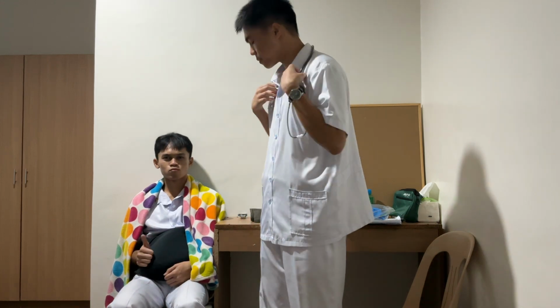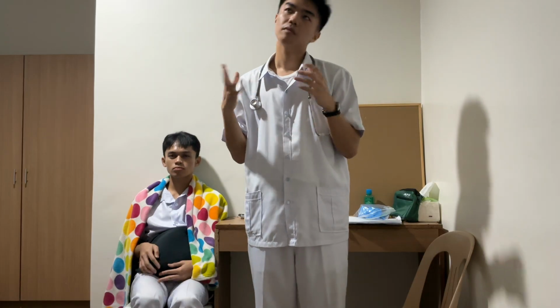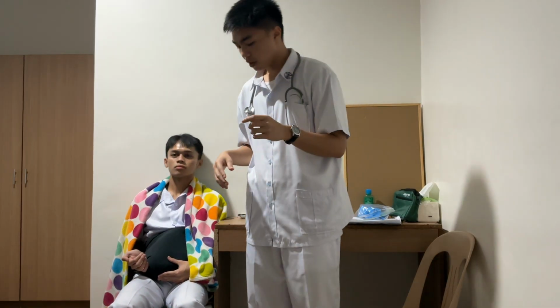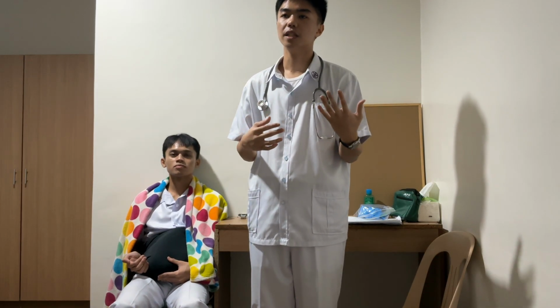Okay, so with that being said, you can take it again as many times as you want to yield accurate results. The best optimal result is to take it as many times until you yield the common blood pressure of each.